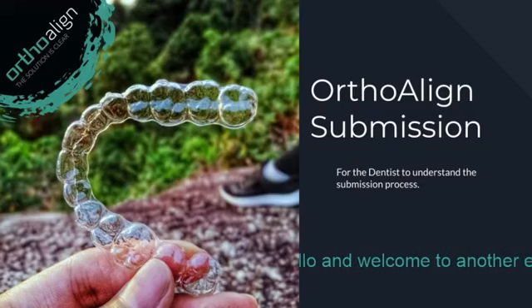So it is very, very important again that all of these are taken into consideration before you send us your impressions of the patient's upper and lower, because the last thing that you want is for us to tell you that we're going to have to reject your impression and that you have to retake that impression again. So good to know is check before you send it. If you're not 100% sure, send us a photo, let us take a look, and maybe we can help, or double confirm if that impression or the stone that you poured is going to be acceptable for doing your OrthoAlign cases. Okay, so important on that.